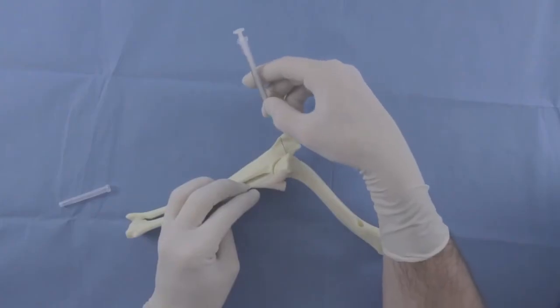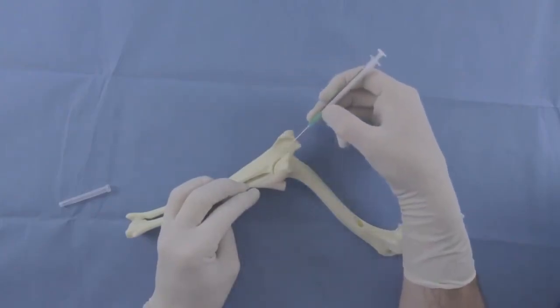Care must be taken to stay on plane. If you are angled too much either way, you could miss the joint space.